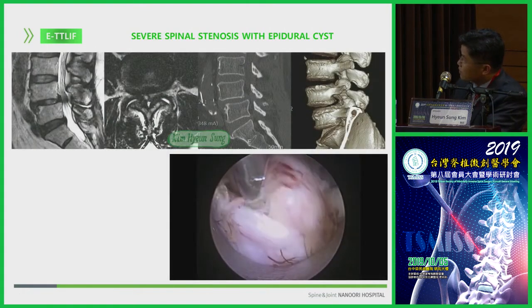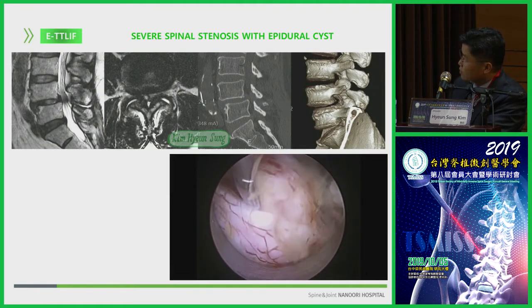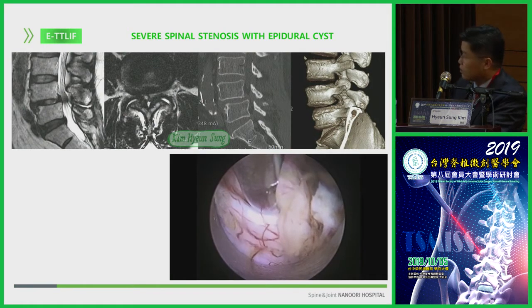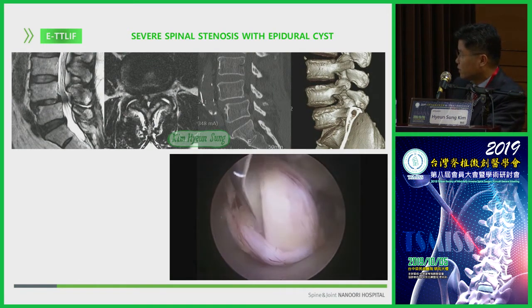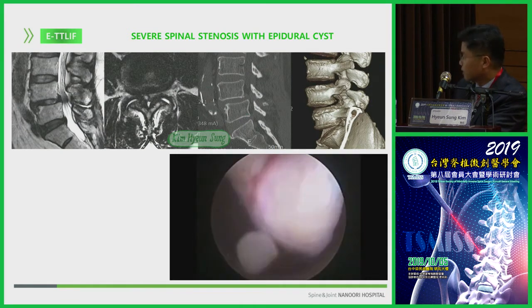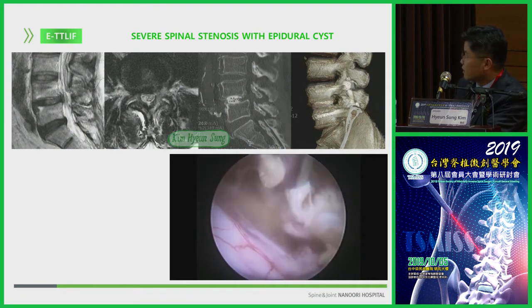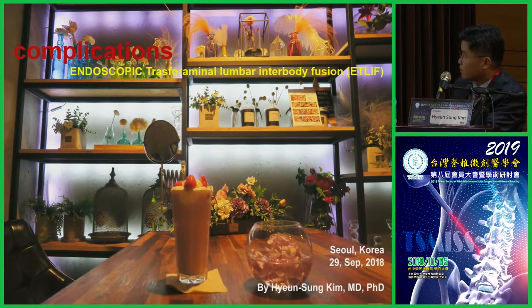And also, this patient needed restoration, decompression, and resection of the cyst. All of it is possible in one step under the endoscope view. Resection of the cyst, and then cage insertion, and then postoperatively, the patient had a good clinical result.